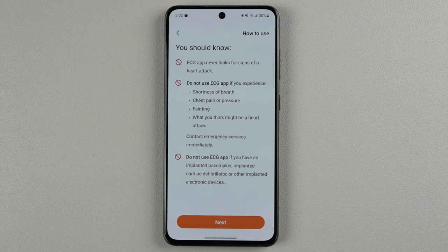You should know that the ECG app never looks for signs of a heart attack. Do not use the ECG app if you experience shortness of breath, chest pain or pressure, fainting, or what you might think might be a heart attack — contact emergency services immediately in that case. And do not use the ECG app if you have an implanted pacemaker, implanted cardiac defibrillator, or other implanted electronic devices. Once you've read all that over, you can tap next.